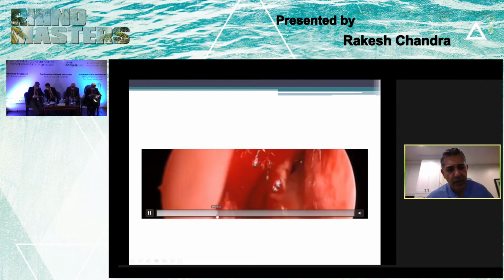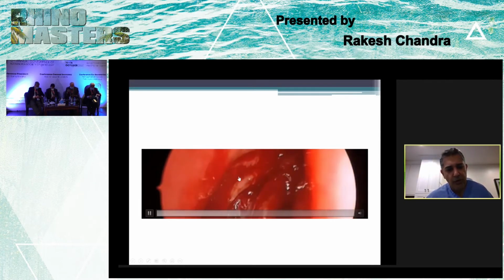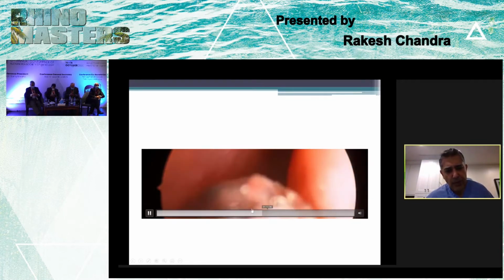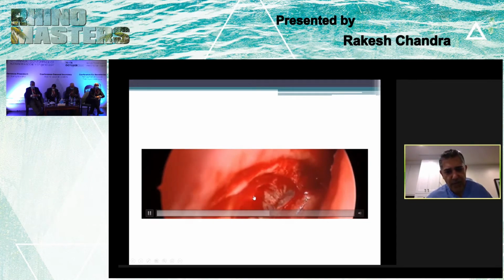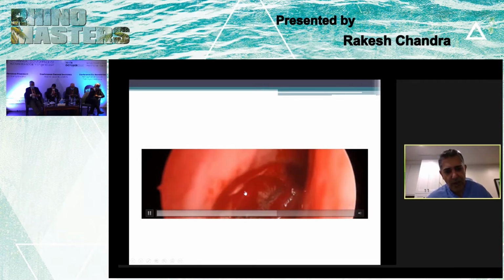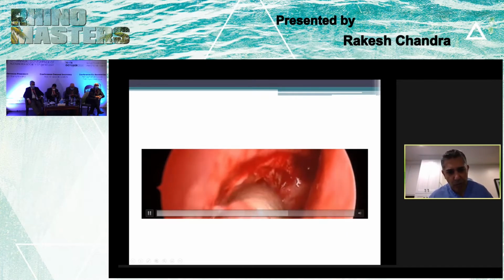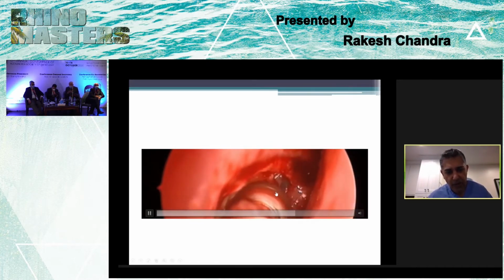We'll speed this up a little bit. So now we see the bone a little bit better here. So in this case, I'm going to use a diamond drill, but before going to that, you see that light pipe where it's transilluminating the undersurface there, and it's just a nice confirmation. The ophthalmologist or the oculoplastic surgeon is just tapping that probe in the sac underneath the bone there, and now we're using a drill to take that bone down.